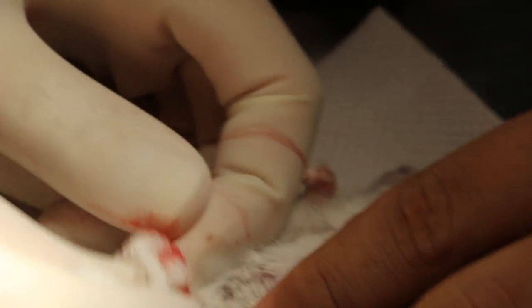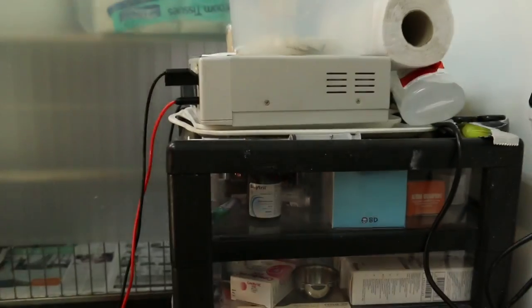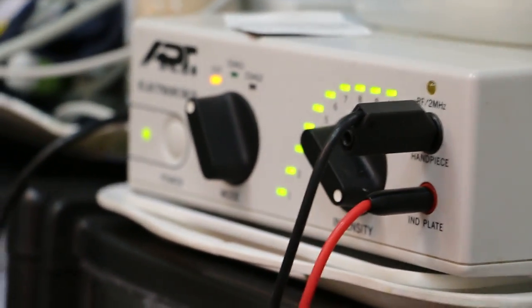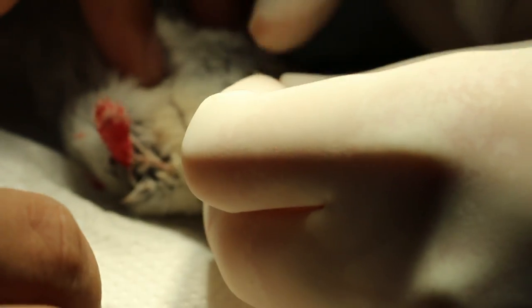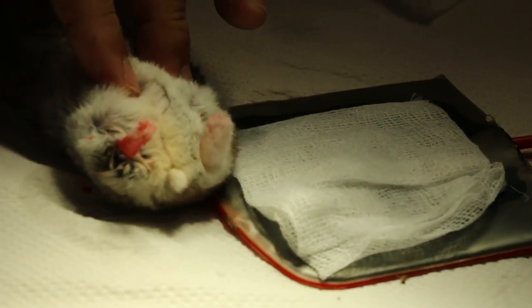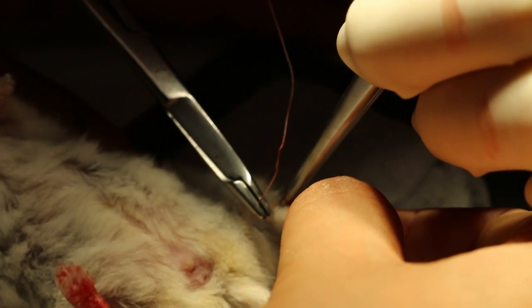The area may have a lot of bleeding. Okay. Electro-surgery machine. Dry. Hamster is given the minimal anesthetic and is alive at the end of surgery. Okay, ready? Stitch it up. Finish, ready? I stitch another one. And I stitch. The other side, I can heal by granulation.